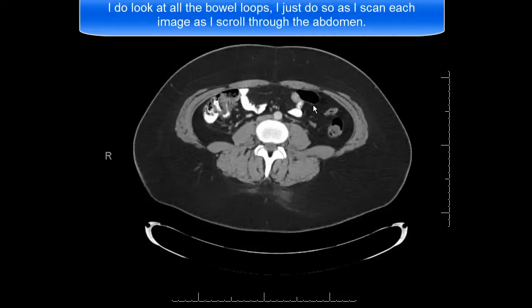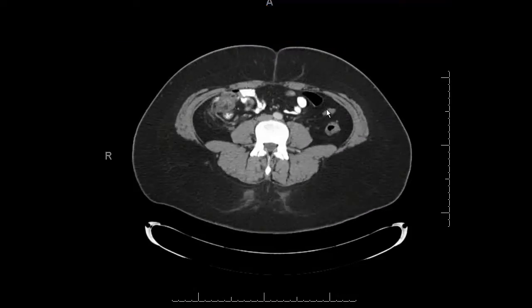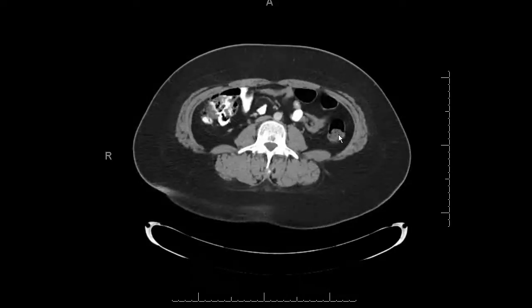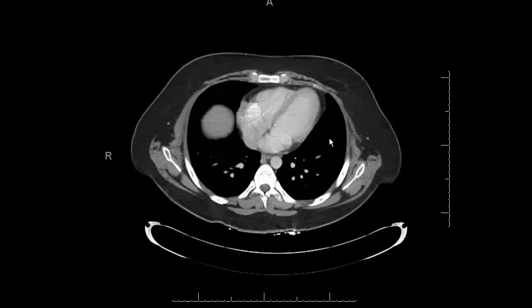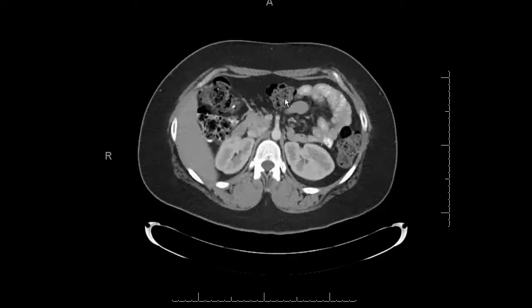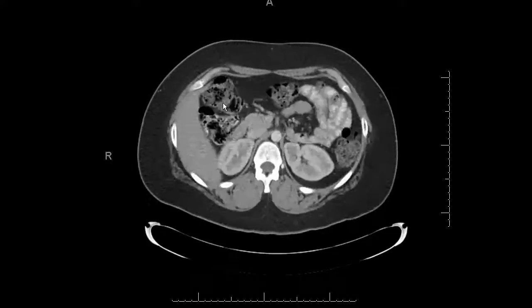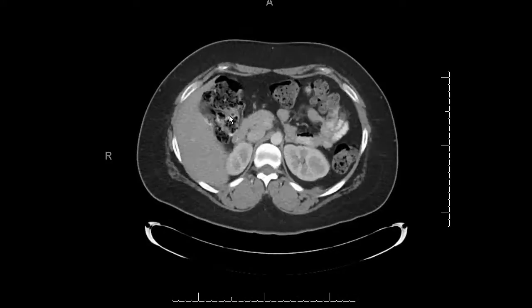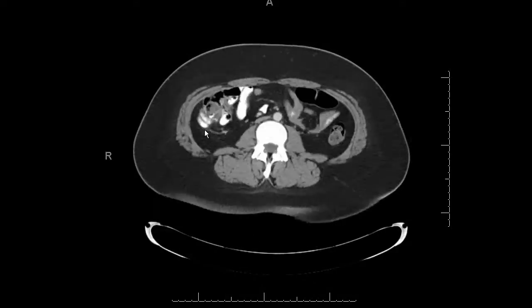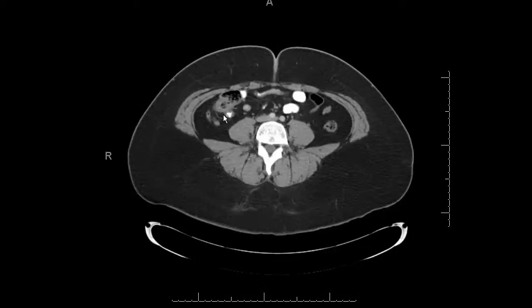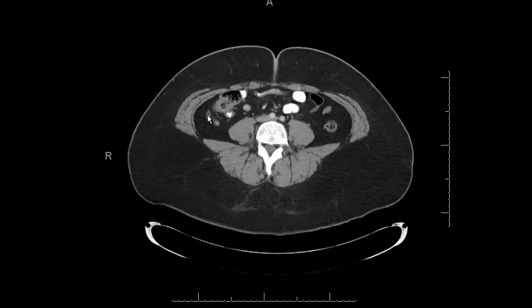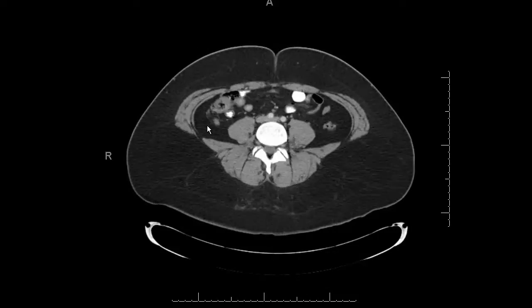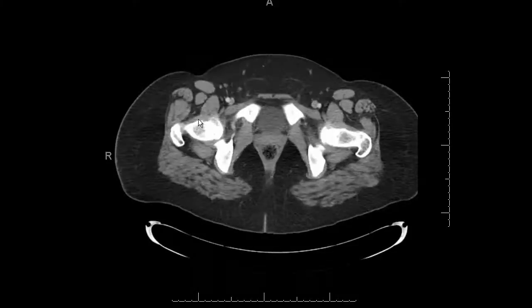I follow the large bowel throughout its course — now going up to the splenic flexure. This is all stool in the large bowel. Make sure you follow the bowel and don't skip over segments; follow it all the way down to the end where you should find the appendix. To find the appendix, look for a small dot of air — once you see that, look around because it's probably the appendix.